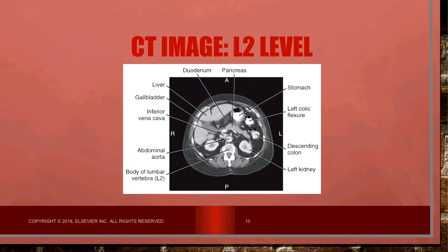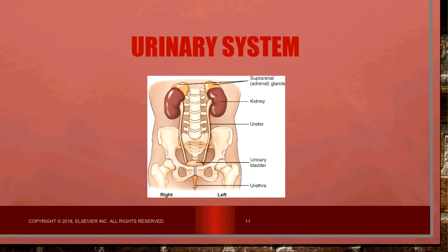They also reference in the abdomen, they show you the urinary system. And the urinary system is typically composed of kidneys, ureters, and a bladder. Typically, a patient has 2 kidneys, 2 ureters, and 1 bladder. And the reason that kidneys are visualized on an abdominal radiograph is because you can typically make out the suprarenal or the adrenal glands that sit on top. So it makes those visible.